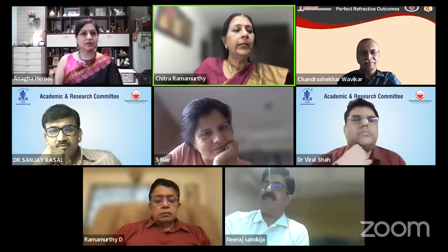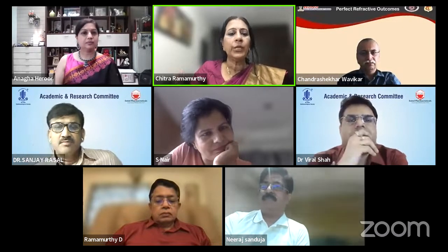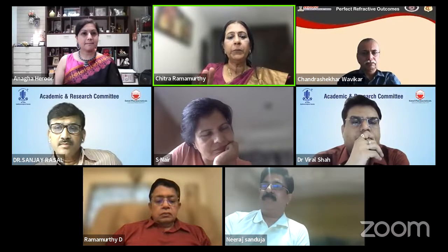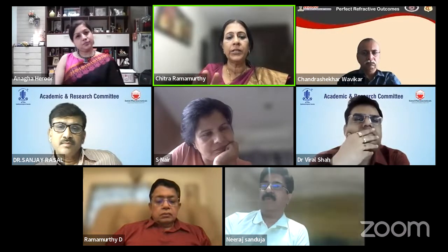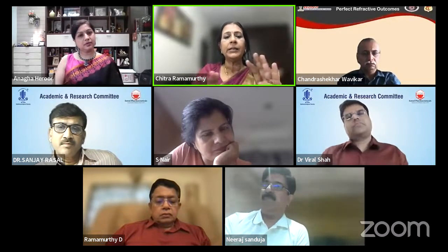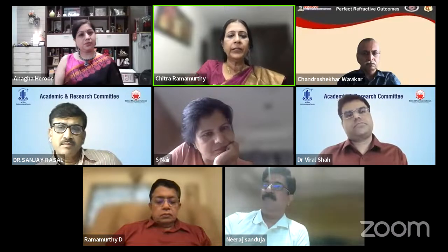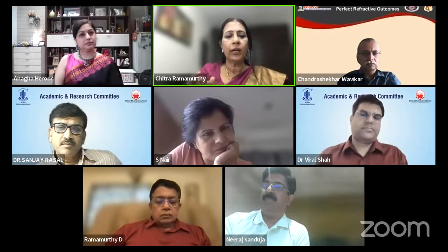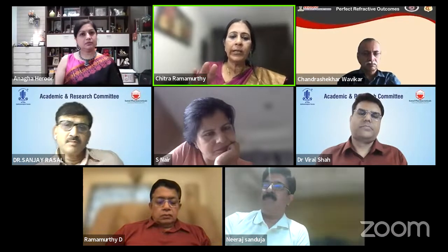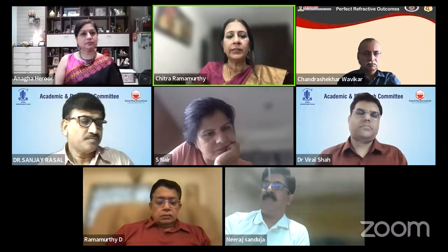Yes, I agree. So the other simple question which I am going to ask is, keeping in mind, of course, that late in-the-bag dislocations are very rare. It's not happening often enough. But does it tell us in this podium here that we think of using a CTR for a high myope or a retinitis pigmentosa case, or in a case of a PXF? Do you feel there is an indication at all, or all of us believe that these things have to be taken on a case-by-case basis?